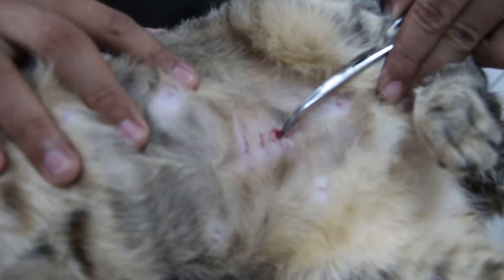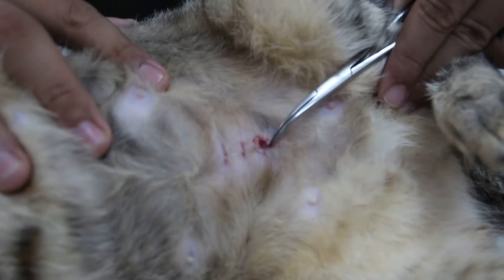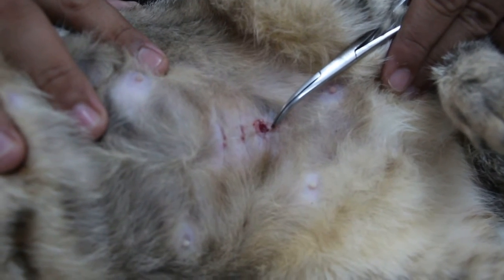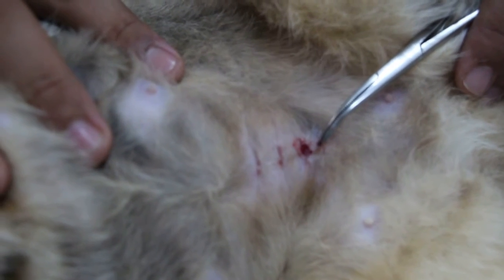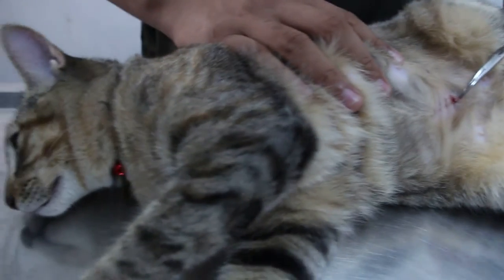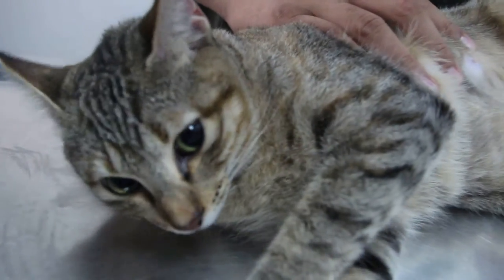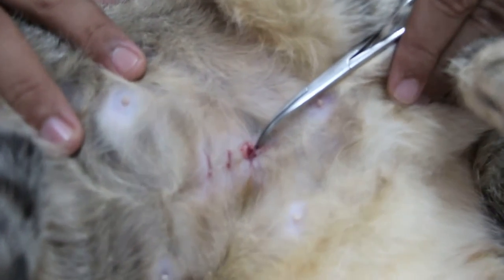This knot is buried under the skin, so you really have to make sure that this knot is taken out, otherwise you'll cause stitch abscess and irritation to the cat. Luckily this cat is quite quiet, so now I take out the buried knot. Out of the four stitches, this is the one which is buried.